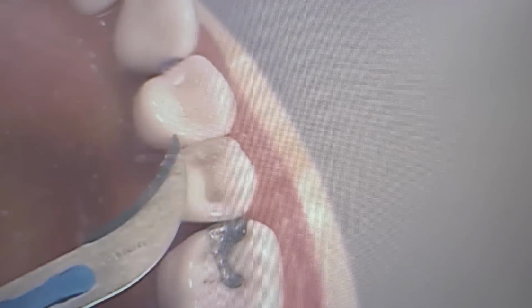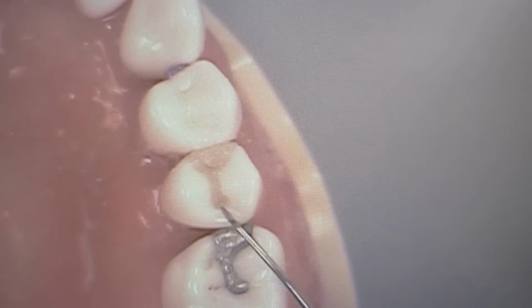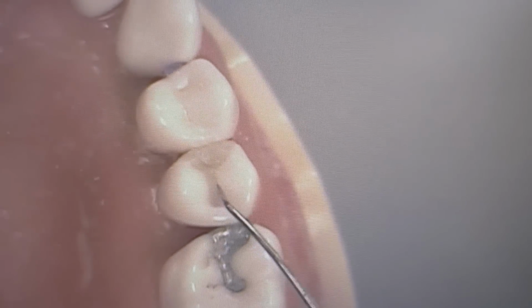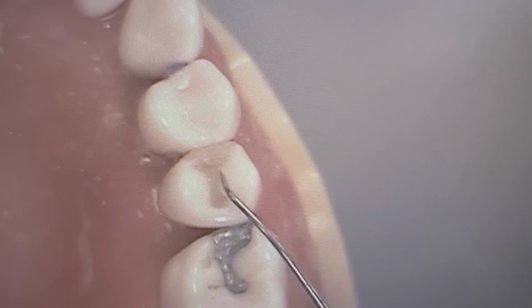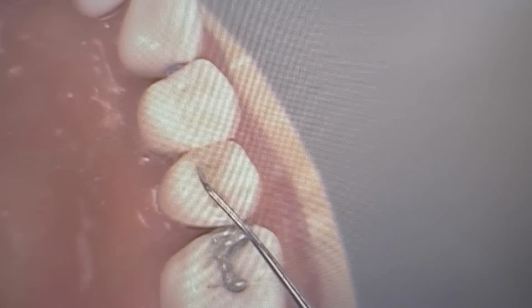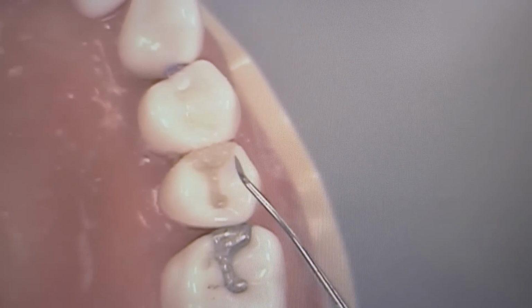Shaping the pits. You guys have an explorer? Okay, so I'm going to use this as my explorer, instead of the explorer because we don't have the explorer right now. Feeling for the anatomy. Slightly sub in this area. Slightly sub in that area. Very nice margin on the palatal.